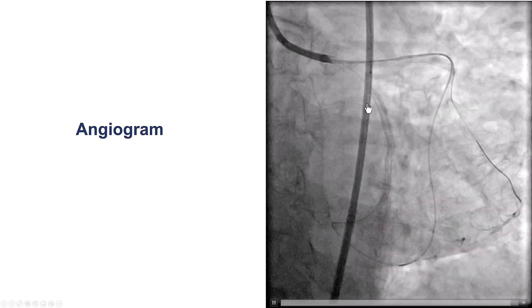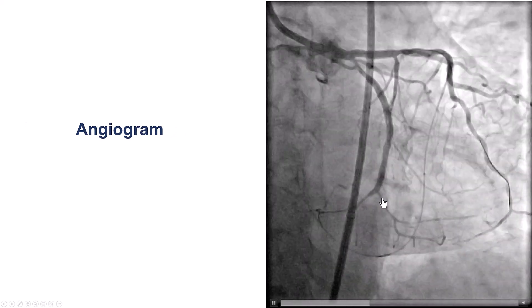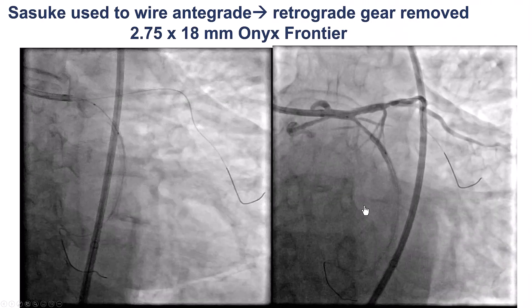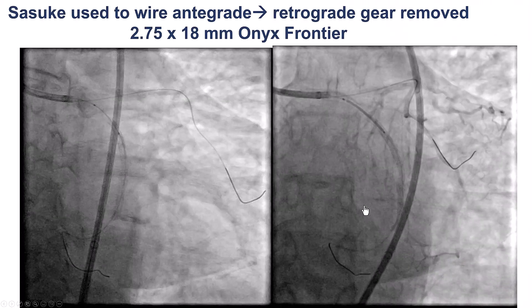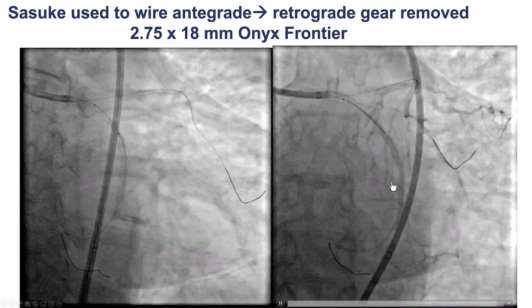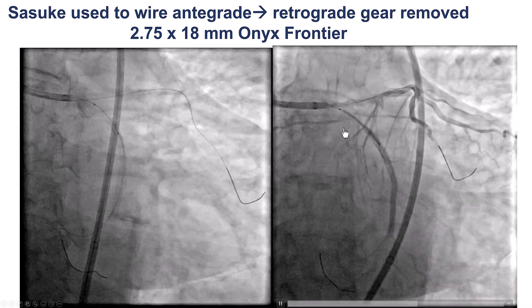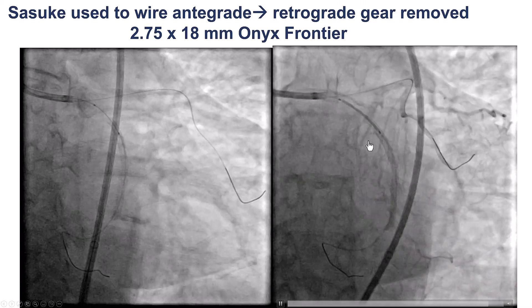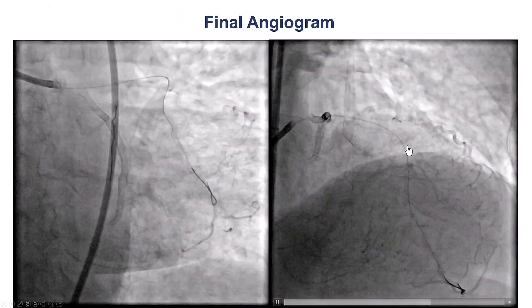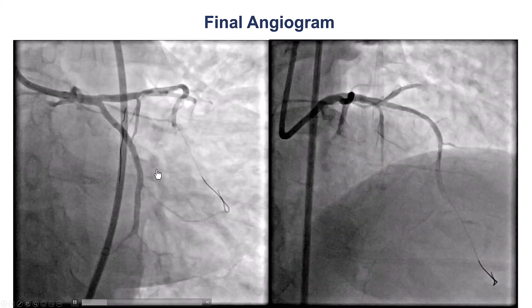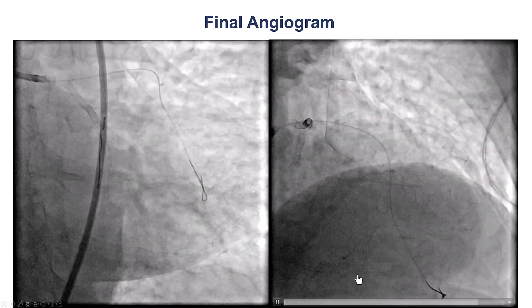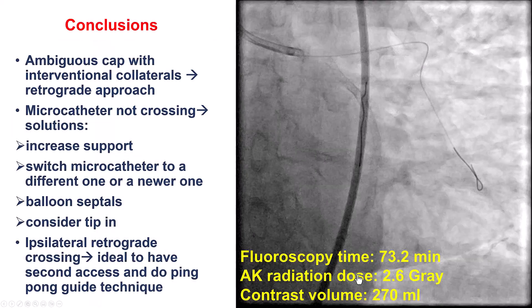This provided a nice result with TIMI 3 flow into the circumflex. There is some diffuse disease proximally and distally, likely due to distal underperfusion over a long period. We placed an additional stent to cover the circumflex, achieving a nice final result with TIMI 3 flow. The septal collateral was checked, and there was no injury.